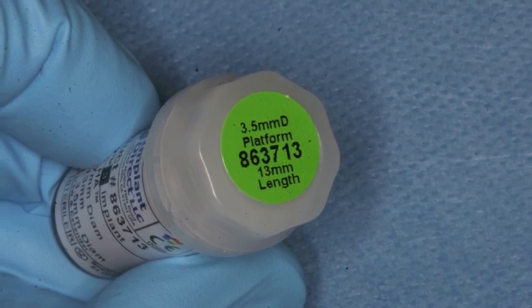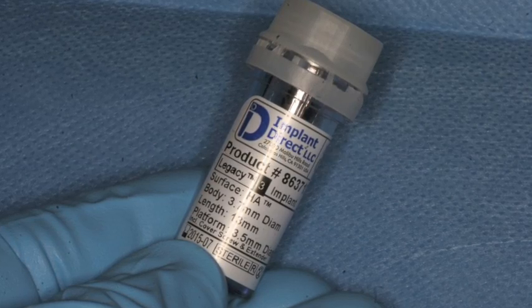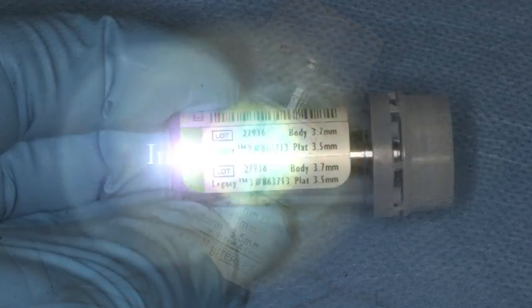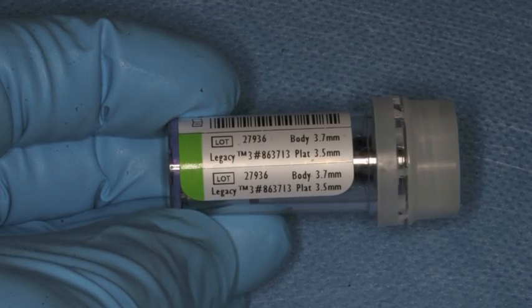The implants are provided in sterile packaging, which allows you to select the size of the implant by its length and diameter, as well as the surface coatings. Tearaway labels for the patient's charts are available on the side of the vial. The vial is opened, and its sterile contents are dropped onto a sterile tray.